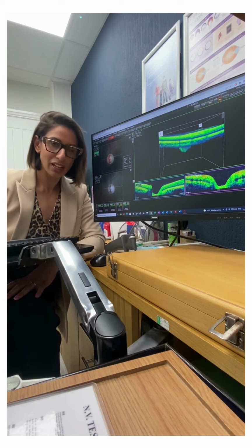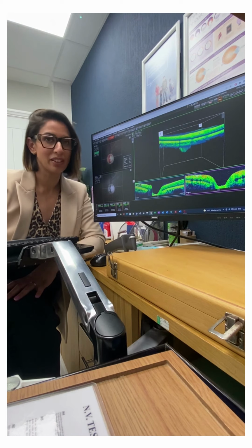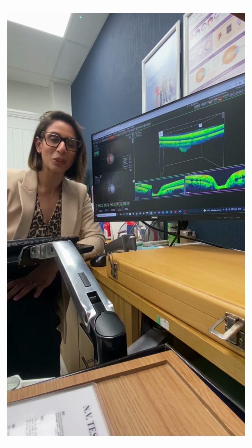We use it as routine for everybody, and we're very experienced in interpreting the data. It's one of my most favourite pieces of equipment.